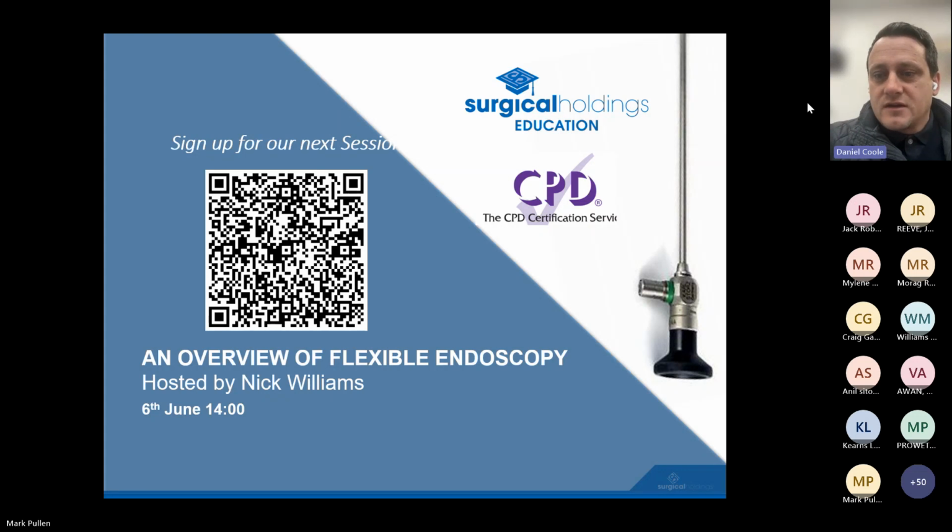Okay, great. And Stephen's asked, are rigid scopes routinely sent back for maintenance? So I'm guessing more of a service, or are they sent back when they're faulty? Yeah, we've got customers that use a service, but generally it's done ad hoc as they break. That's why we mentioned auditing as an added service, as preventative maintenance. Because if you don't pick up things like contamination early, it could spread throughout the whole system, which would then need to be replaced. So it's very important that you are either auditing your scopes yourself or you have a service that's done for you.